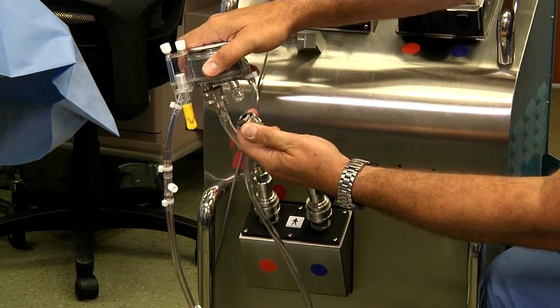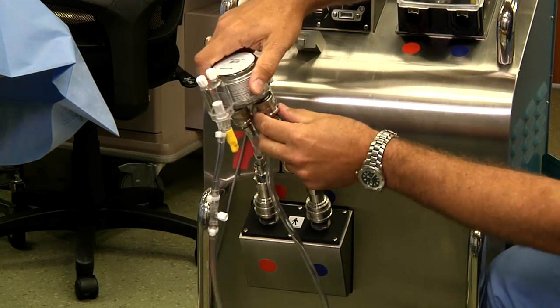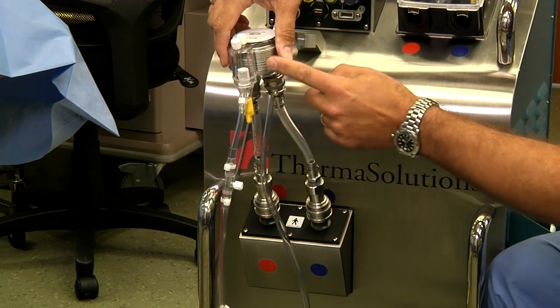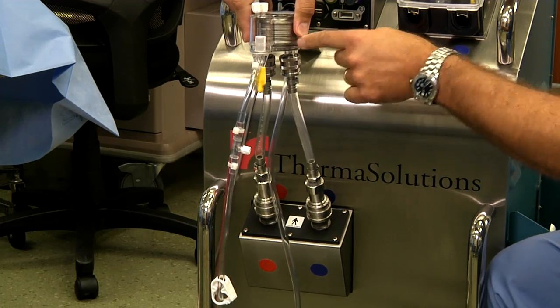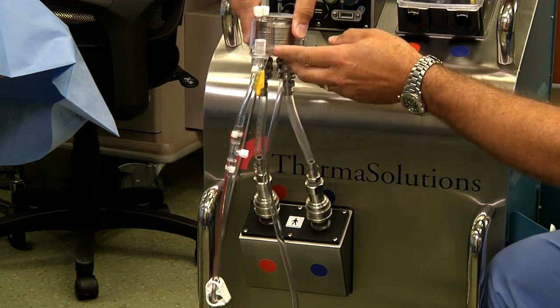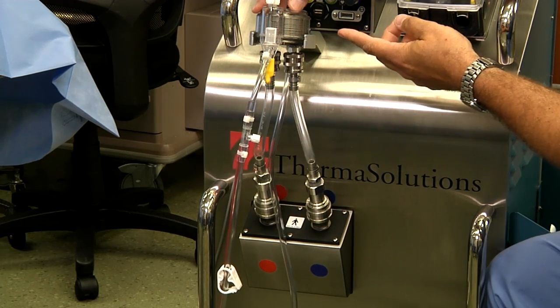The bezel is pulled back and pushed into place, and we make sure the connections are secure. Once the water lines are hooked up to the heat exchanger, it is placed into the bracket. There is a groove on the front of the heat exchanger that matches the groove on the bracket, and it simply snaps snugly into place.